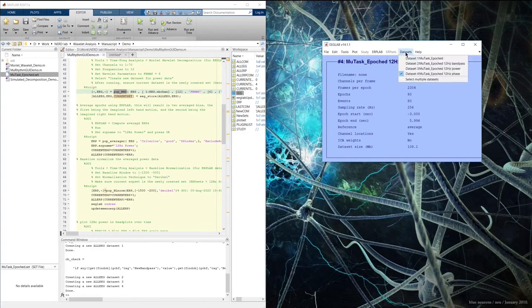Once you convert to power or phase data, you need to be very careful using all EEGLAB and ERPLAB functions, because EEGLAB and ERPLAB do not realize that you're no longer operating in microvolts but in microvolts squared or radians. The same goes for complex values. Now that we have the 12 Hz power data extracted, we can go on to compute the mu ERD.